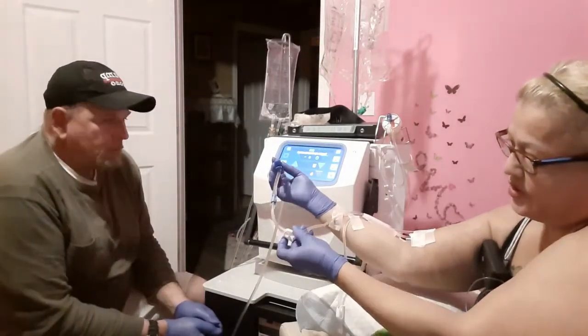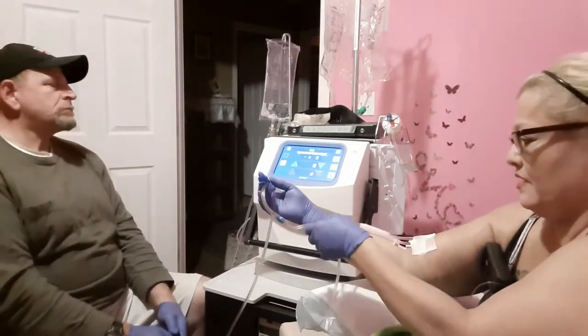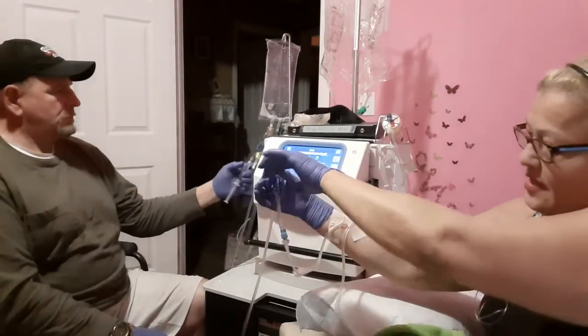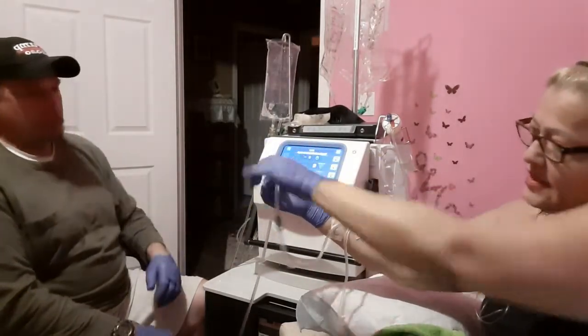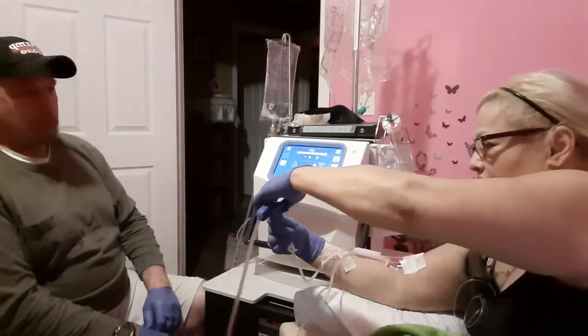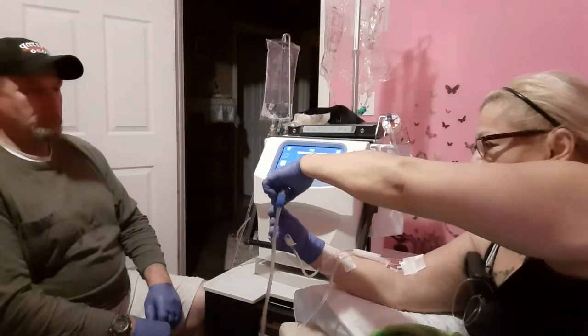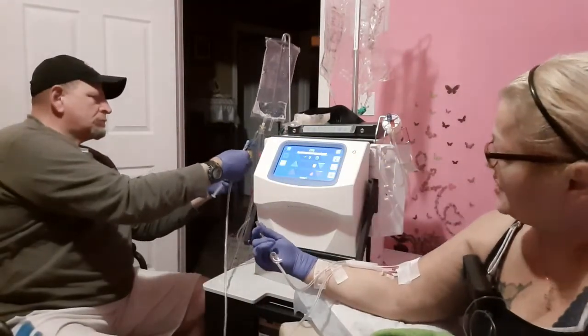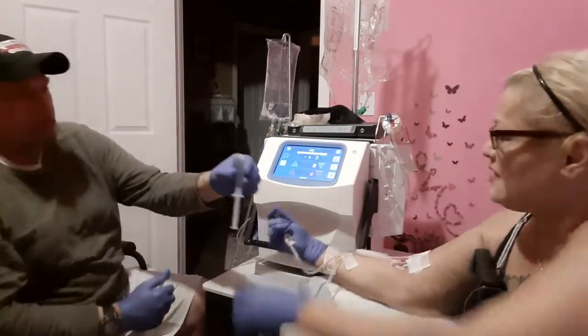So, we're going to clamp. Hold on. Clamp the white on the venous, clamp the blue, which is venous, and then I'm going to disconnect here. Huff's is just going to give me the syringe. He's going to clamp. It should already be clamped, I guess. No, maybe not. It's already clamped.